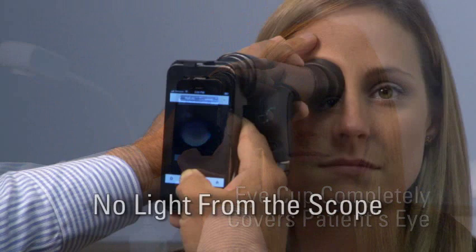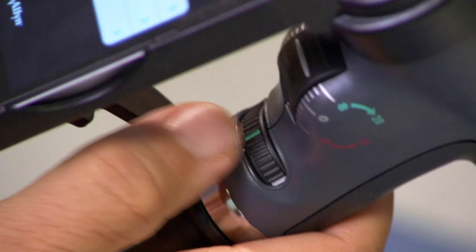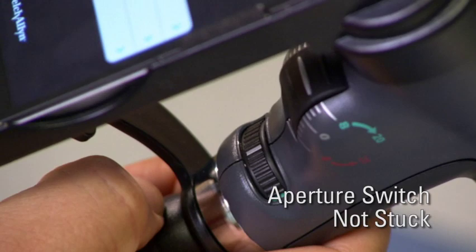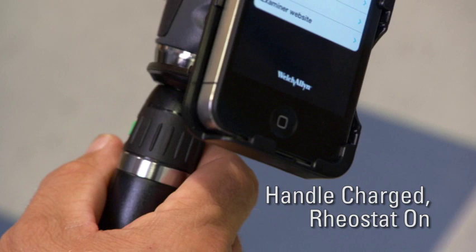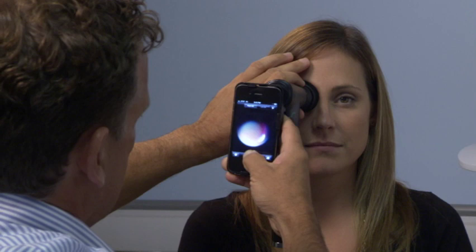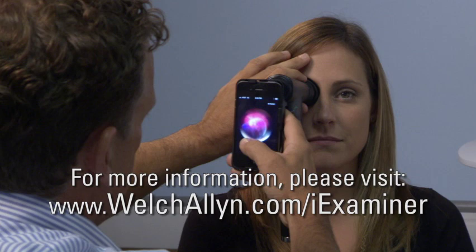Make sure the eye cup is completely covering the patient's eye. If no light is coming from the scope, make sure the aperture switch is not stuck between apertures. Make sure your handle is charged and the rheostat is turned on. Remember that practice is the key to becoming proficient. With frequent use and repetition, you'll experience a rapid learning curve. Over time, we are confident the Eye Examiner will become one of your most powerful diagnostic tools.